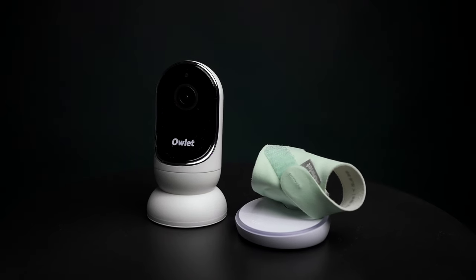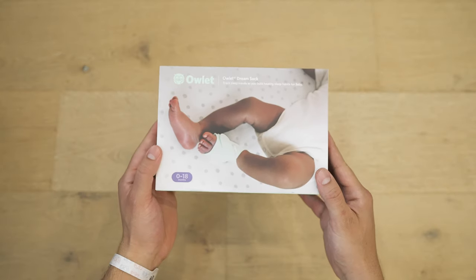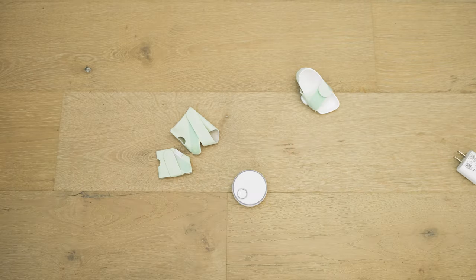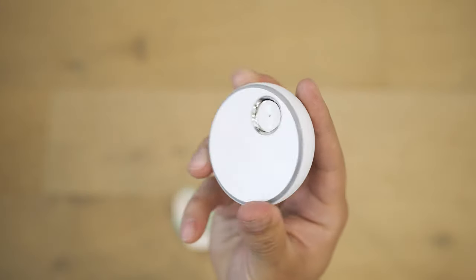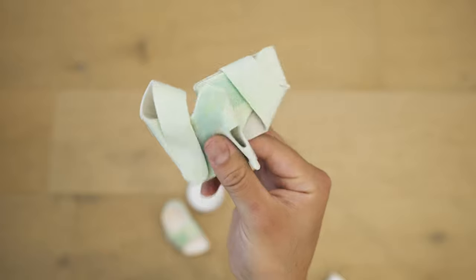We recently got our hands on the Owlet Dream Sock Duo. While we mostly plan on using Miku for baby number three, we really wanted to give the Dream Sock a go, especially in these early weeks. We'll touch on the camera a little bit later, but let's focus on the sock to start. Out of the box, we're looking at the sock and sensor, base station, power adapter, power cable, and larger size socks.